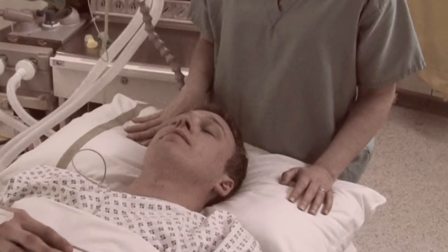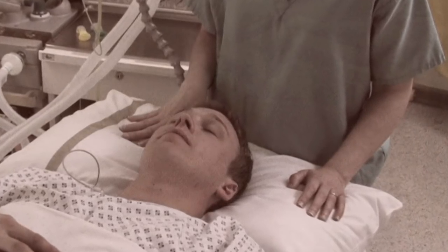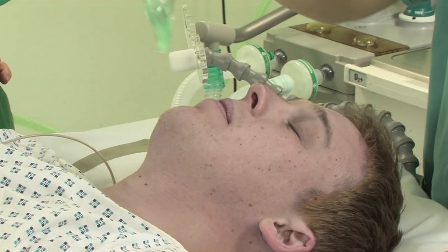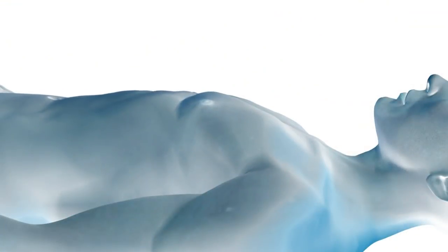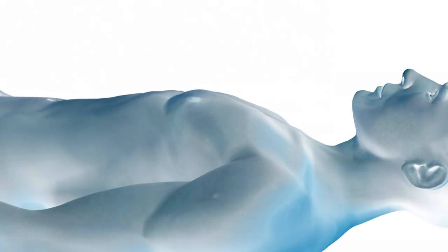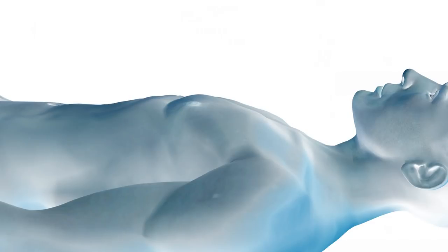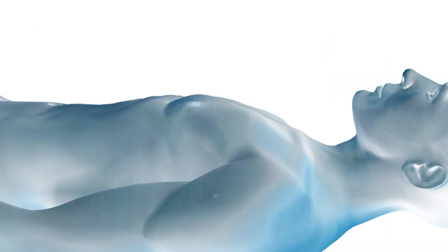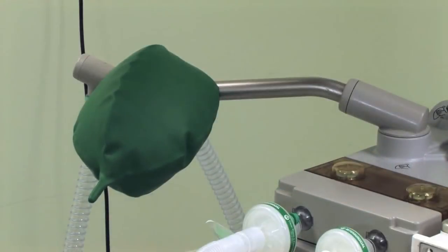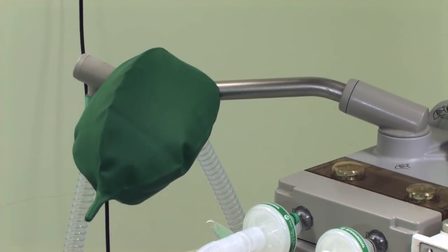Clinical signs of an obstructed airway include noisy breathing, increased cyanosis, seesaw movement of the abdomen and chest, and in-drawing of the supraclavicular, suprasternal and intercostal spaces during obstructed inspiration. Additionally, there can be seen a reduction in the movement of the reservoir bag of the anaesthetic breathing system.